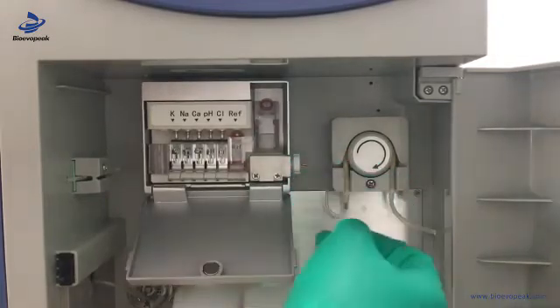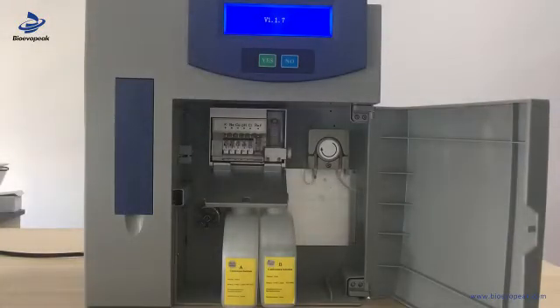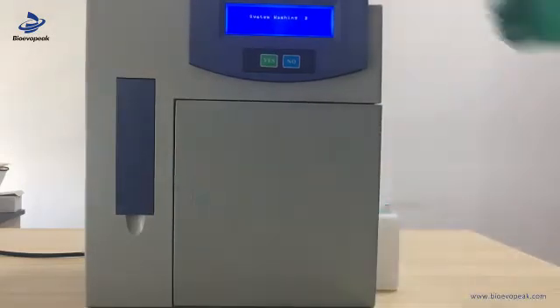We also need to press the electrodes to keep them in line, and we need to pay attention: do not fold the pipe. Now we can switch on the machine and it will auto-check in, with auto-washing for the pipelines. We can close the electrode door and the front door. It takes some time to wash the pipeline to maintain the liquid path.